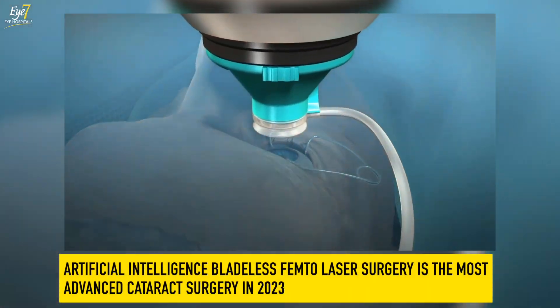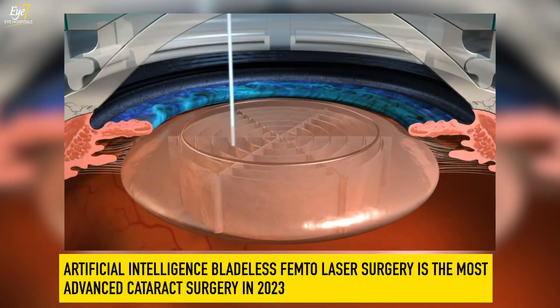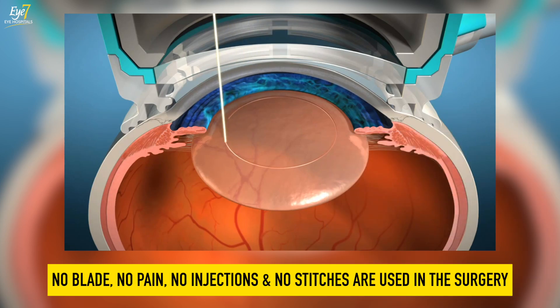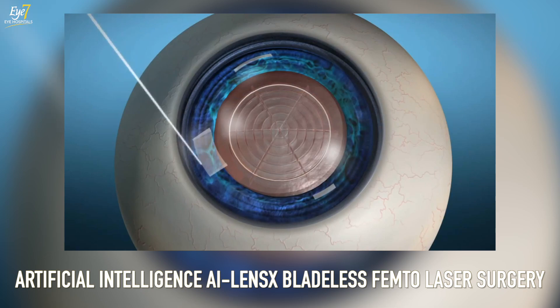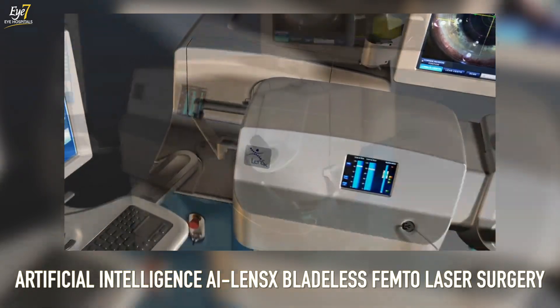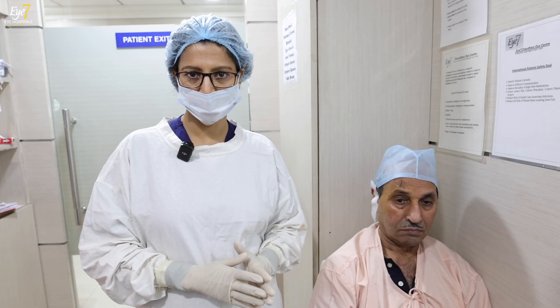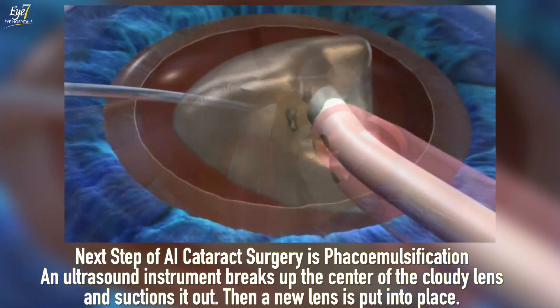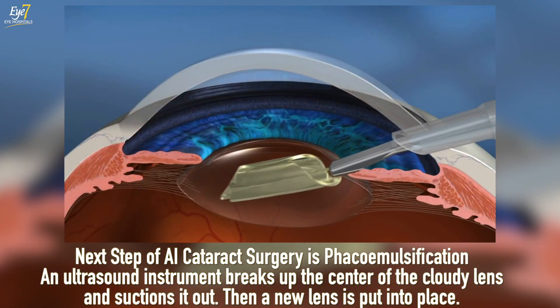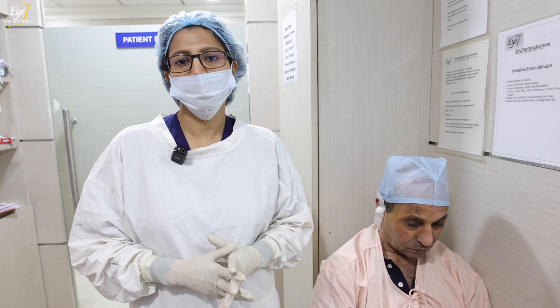This is an artificial intelligence assisted cataract surgery — a modern day surgery. There is no problem for the patient; there is no injection and no tension. All the incisions are made by the femto laser machine. All the steps of the surgery are done by the femto laser machine. Once the cataract is dissolved, we take the patient to another OT where we remove all the broken down cataract parts and do the lens implant.